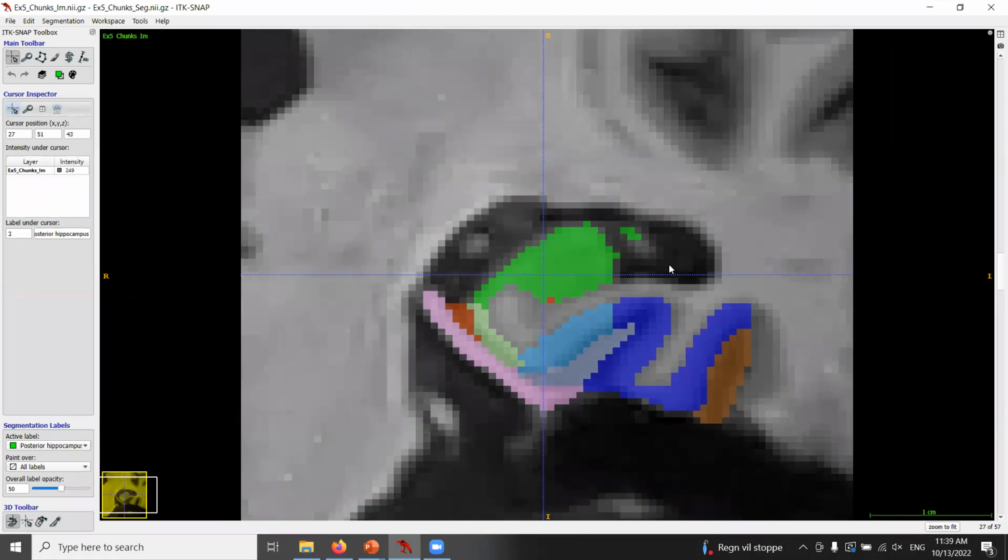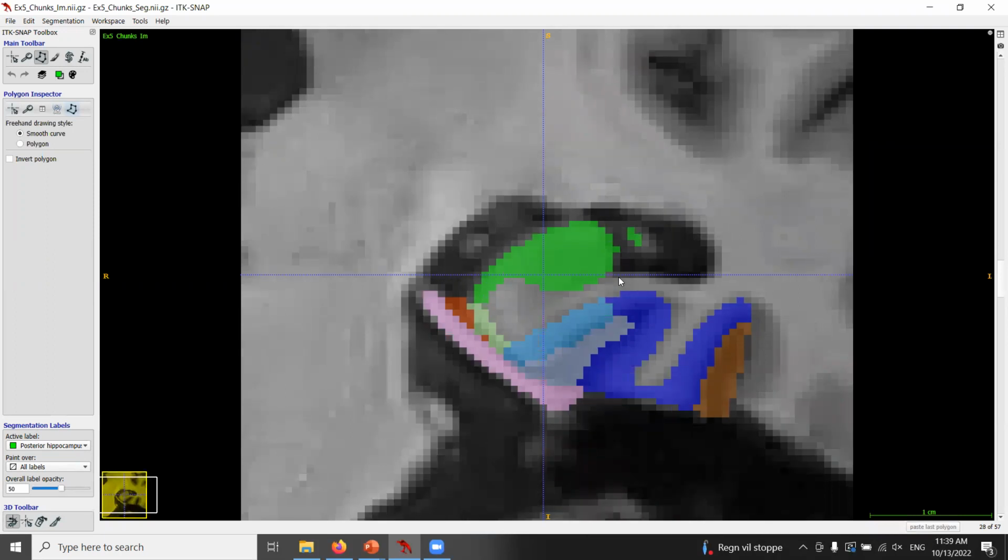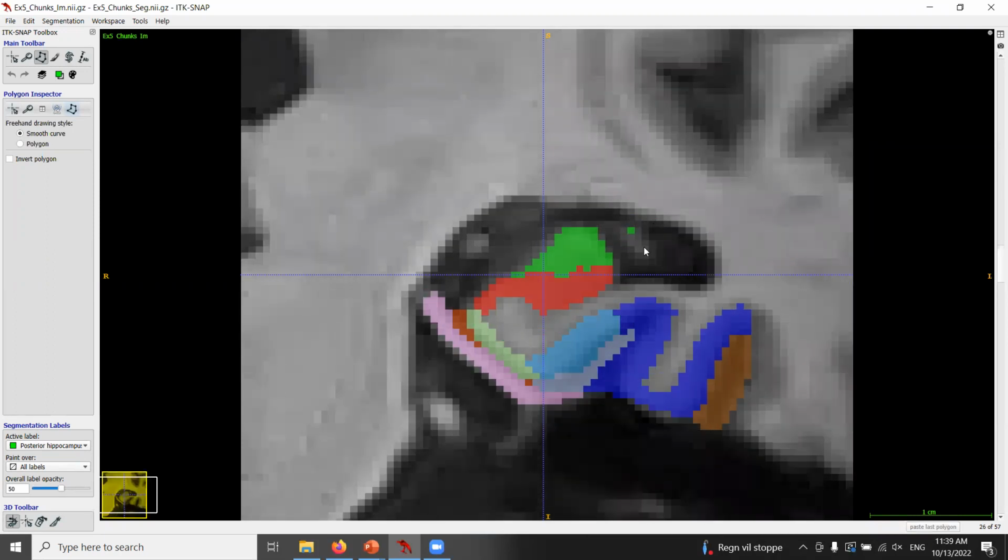But you can see it's this that we're looking at. So that's right on the choroid plexus. If I press S, I turn the segmentation on and off. So that shouldn't be there, but it's just on 4 slices. It's very few voxels, so I would say this is not a problem. I would include this case and probably not even edit.